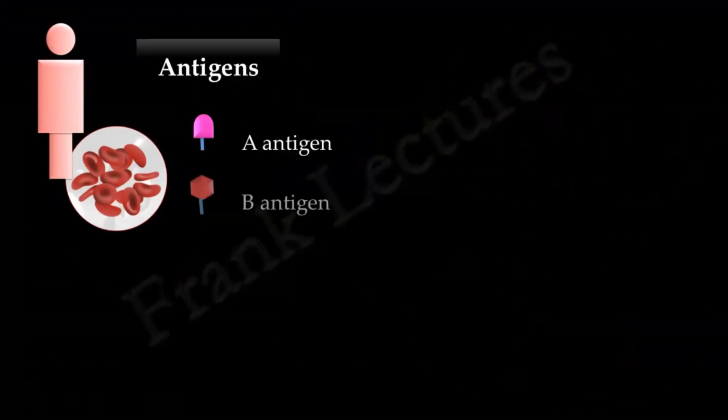For this test, we will require a few drops of blood from a person whose blood group is to be determined. We know that blood will contain the target antigens on RBCs. These target antigens are A antigen, B antigen and Rh antigen. We will detect the presence and absence of these antigens in blood and determine the blood type.